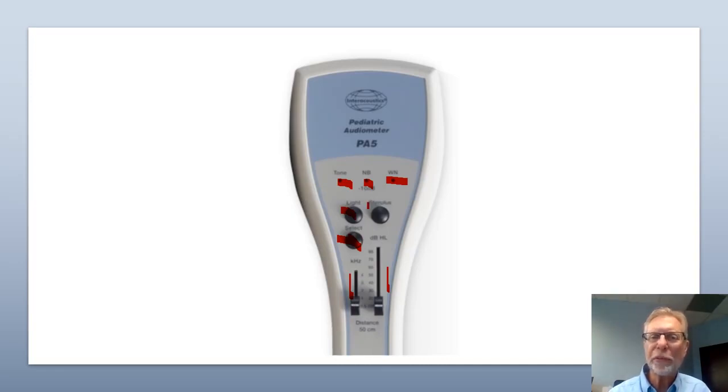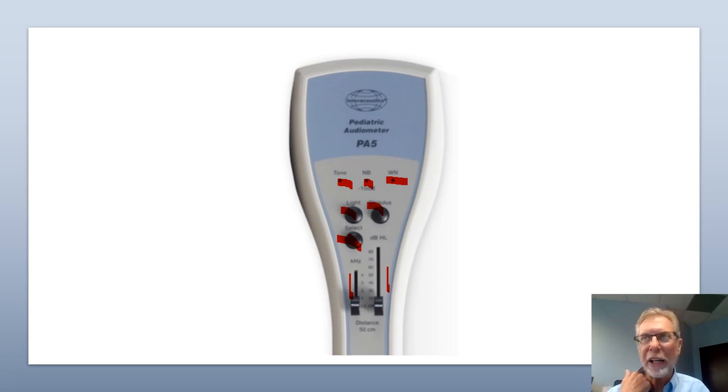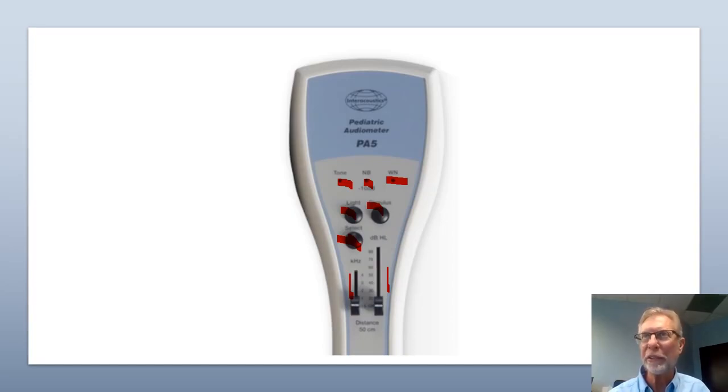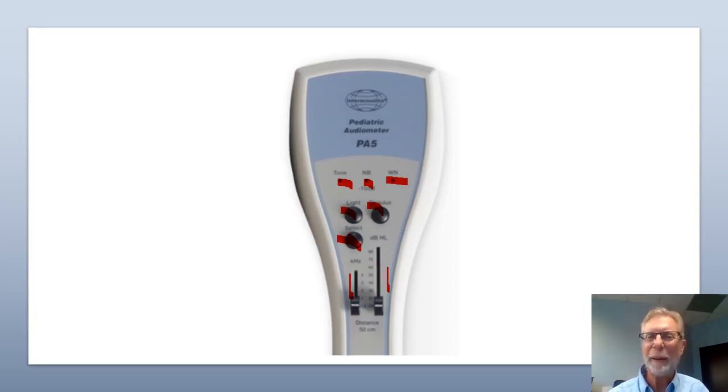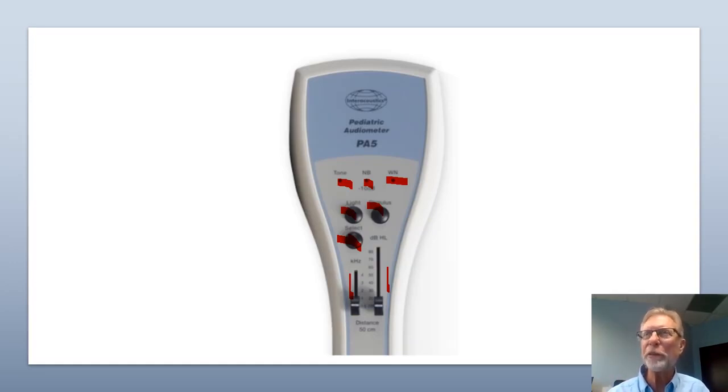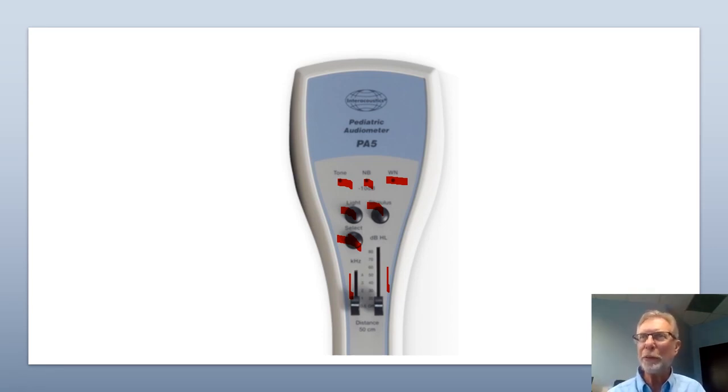So hopefully that has helped. It's going to take some practice with pediatric patients. And the best thing to do is test adults first. You can even do this on yourself. Remember that the distance from the speaker to the patient, and you can be right in front of the patient, it needs to be somewhere between 12 and 16 inches away from it.